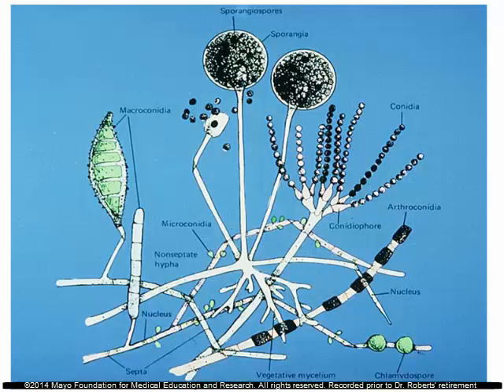The next image shows you a schematic of what you might see. This is a drawing with fungi exhibiting all the different kinds of spores that might be produced. Maybe not all, but a lot of them. It gives you an idea of what you might expect to find with certain of the cultures. And I kind of call it the universal fungus because it has everything there.